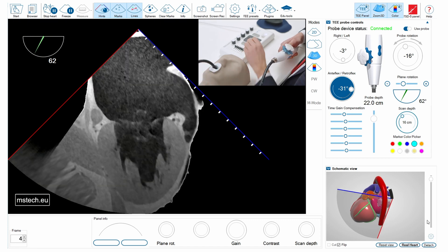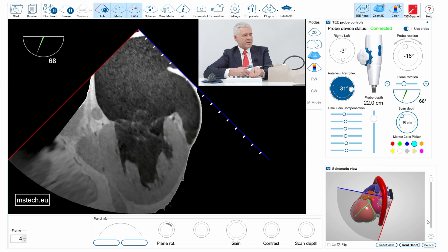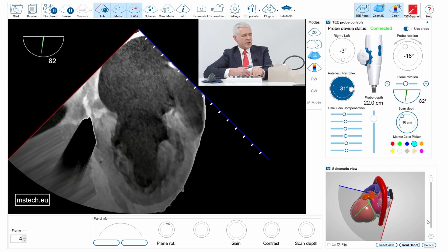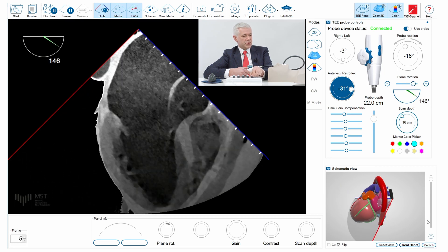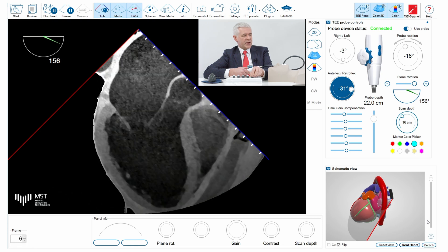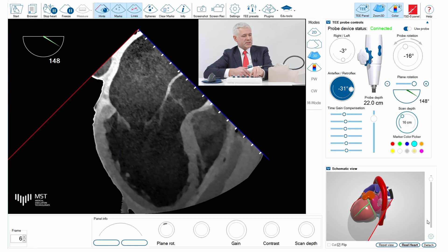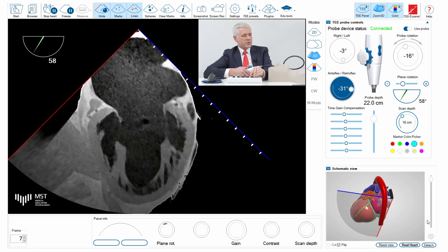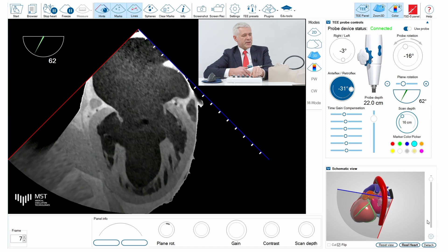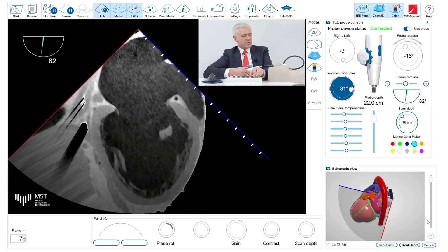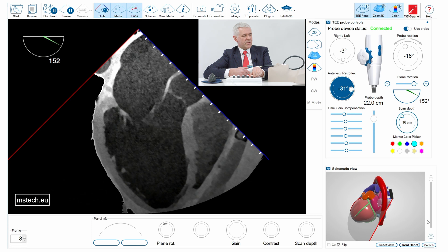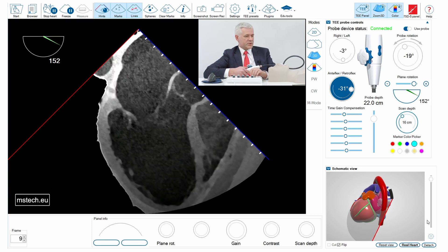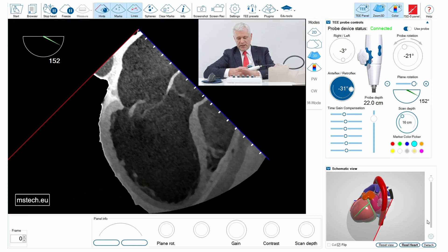I can verify by increasing the angle further. Since I was at 62 degrees in the intercommissural view, adding 90 gives me 152 degrees, and now I have the long axis view of the left ventricle and the mitral valve.